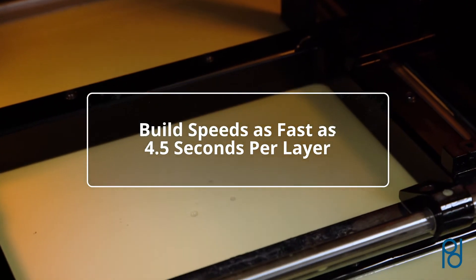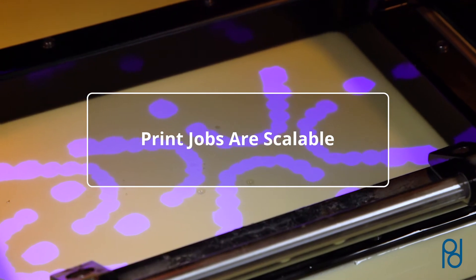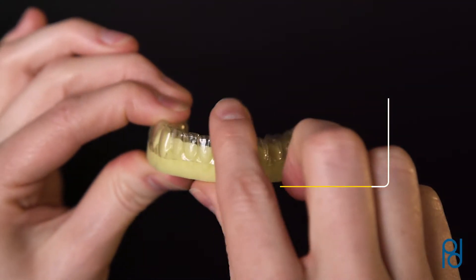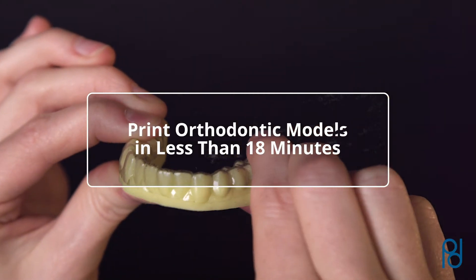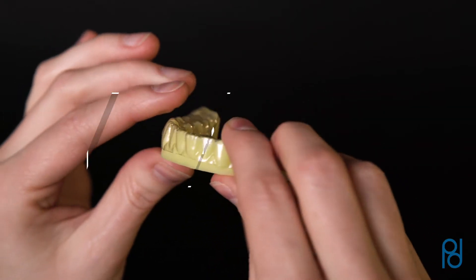JUUL 3D3 builds at speeds as fast as 4.5 seconds per layer, and print jobs are scalable. Whether you're building one quadrant or 18 arches, the layer build time remains the same. Print orthodontic models for complete clear aligner treatment in less than 18 minutes.